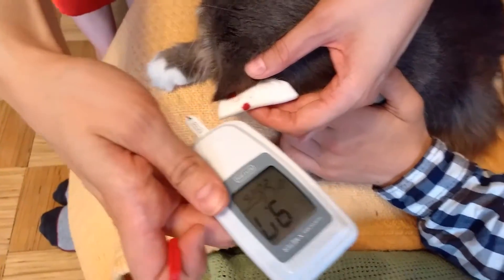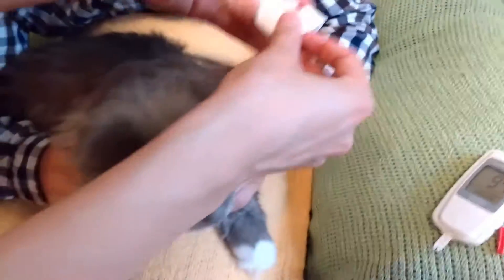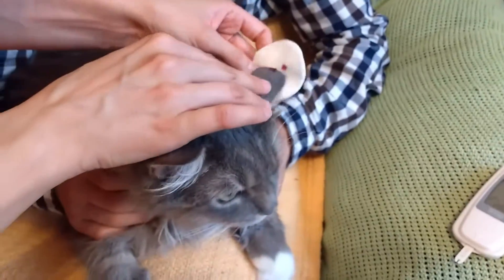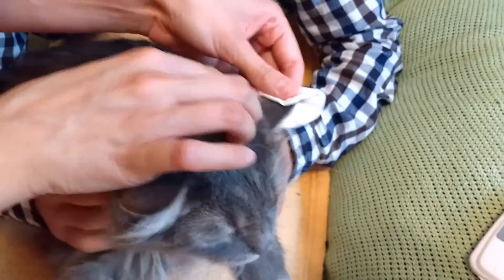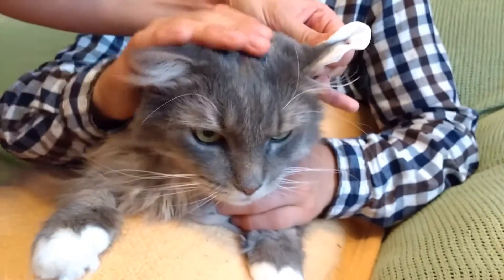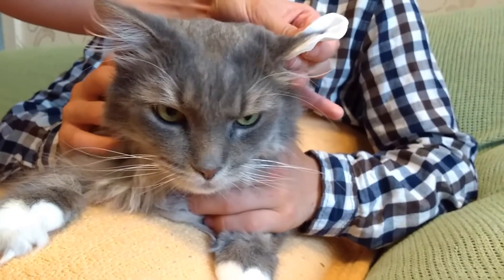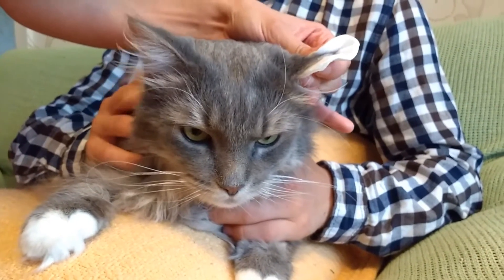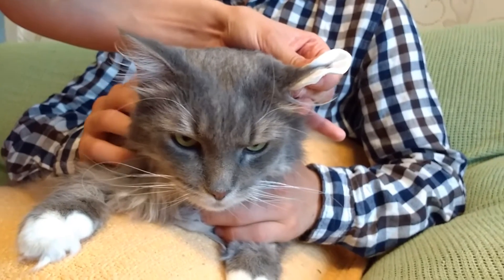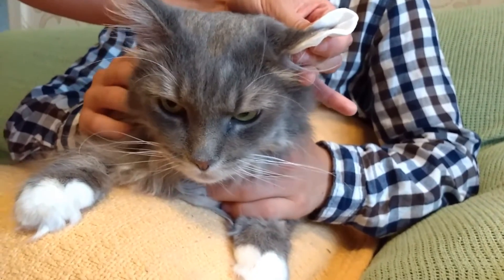It shows 9.7. Then it's very important to put the pressure on — otherwise you will have a cat who has bruised ears, and then you will have to measure blood sugar and you can't do it. So it's always good to put pressure on.